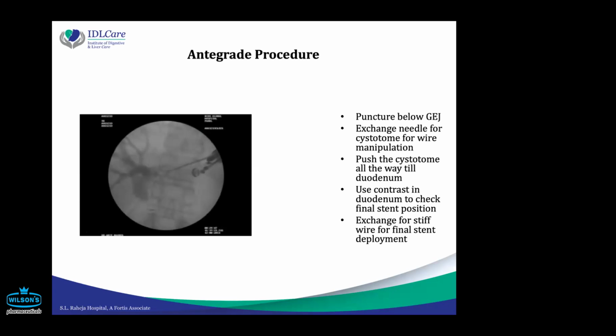Actually, the procedure, we have learned the details of the technique from the interventional radiologist. The advantage of antegrade procedure is you are draining through the papilla. We don't know whether that's an advantage, but you get to use the normal stents that we use for ERCP, an uncovered metallic stent, which is much cheaper than the EUS specific stents which have become available now. So it saves on cost.